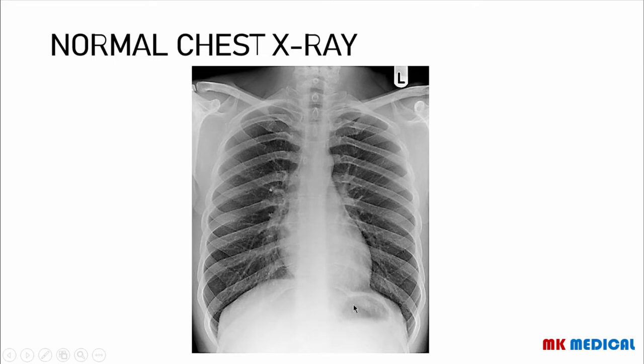The stomach, which is over here, we can see underneath the left side of the diaphragm because of the air that's in the stomach. You refer to this as a gastric bubble. And then, of course, we can see that the bones here are off-white. And then, of course, the marker here is completely bright white. Okay? So this is a normal chest X-ray. We shall be able to understand and read this systematically by the end of these review lecture videos.